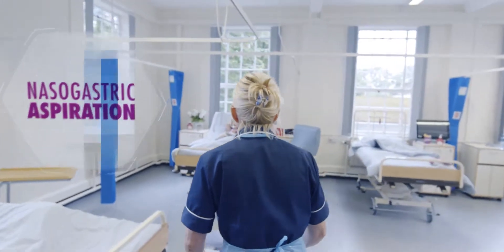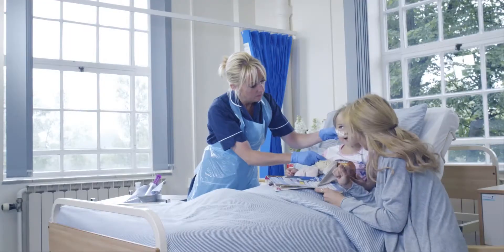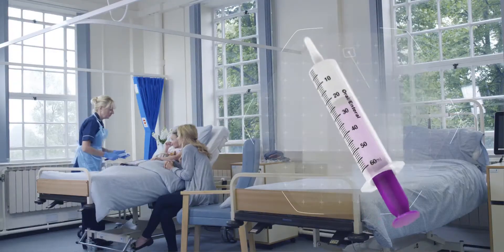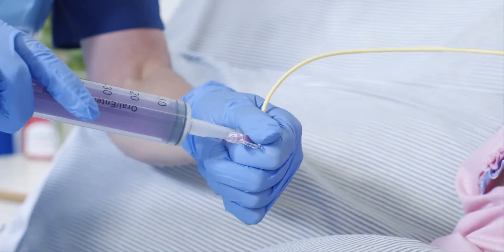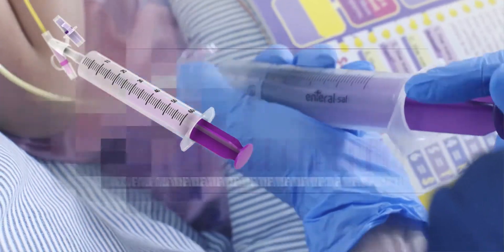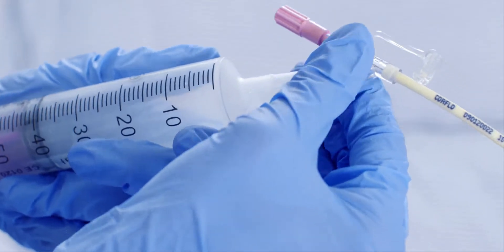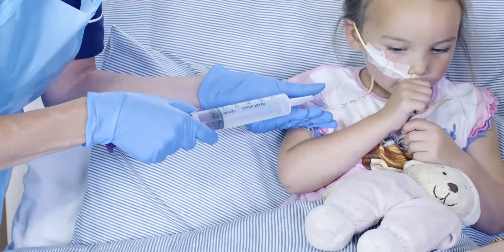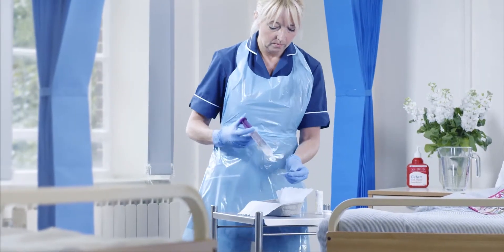Nasogastric tube placement testing is mandatory and has remained unchanged for many years. Prior to every feed or medication, a 60ml syringe is attached to a nasogastric tube and repeated attempts are made to suck up aspirate from the stomach. When the aspirate is finally extracted, it is transferred to a separate vessel and tested on a pH strip to check whether the tube is actually in the stomach.